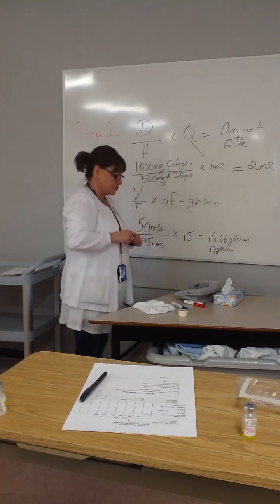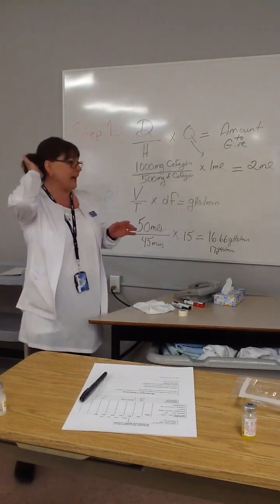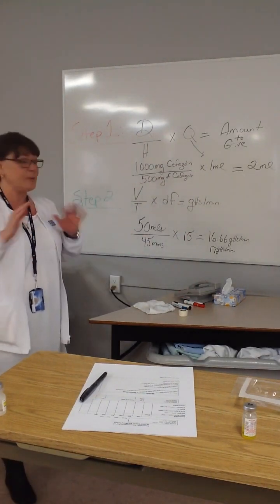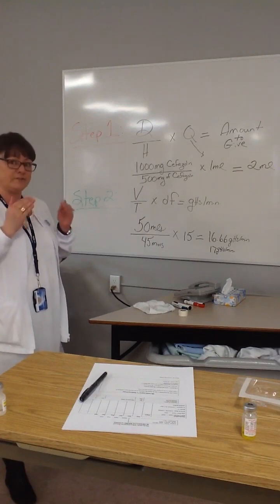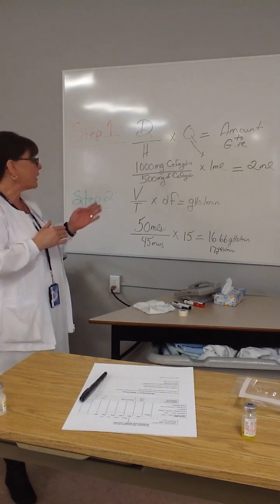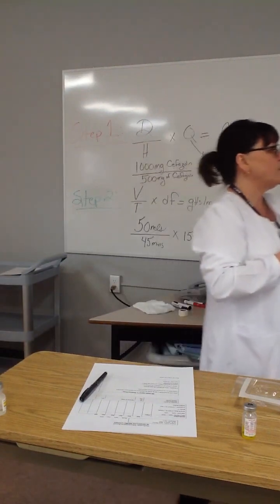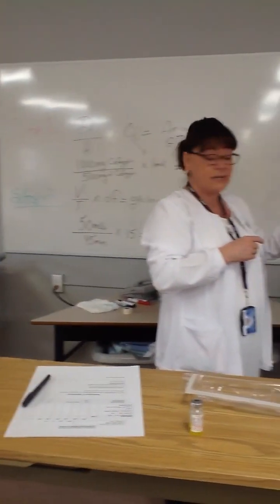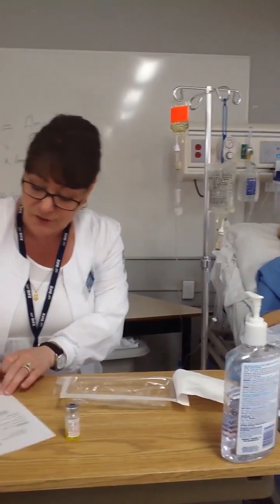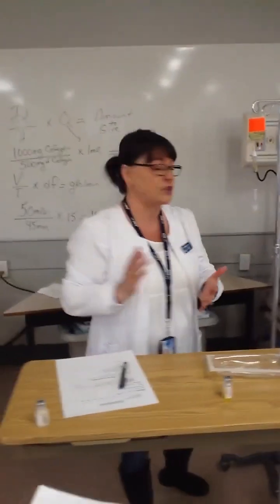And as you start to count your drops, 17 is going to be a bit of a difficult number to count over a minute. You can simplify that by dividing it all into 4 and doing little 15-second increments. And so now we're going to count our drops, and you can be off one either way. Okay? So we're going to come back over to our mini bag, and of course we can add our final answer, which would be 17 drops per minute, on our little information sheet that you would pass in on your demonstration day.